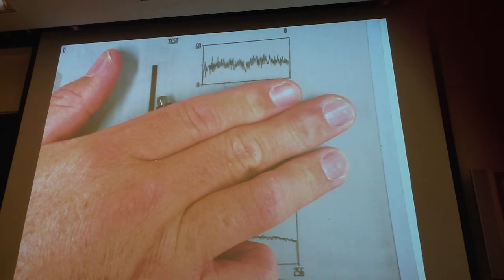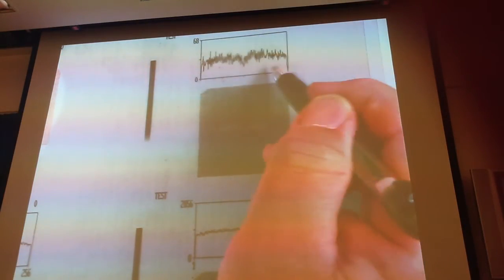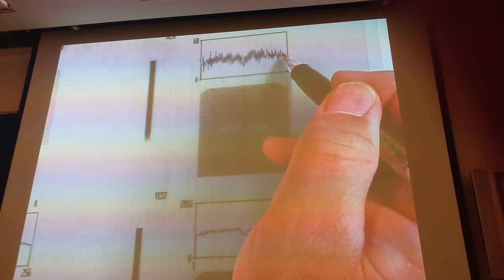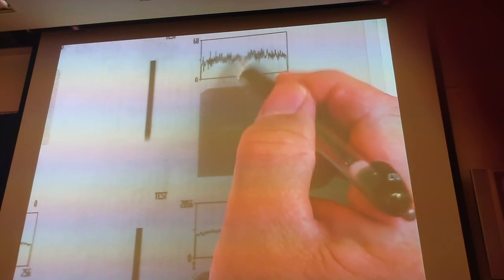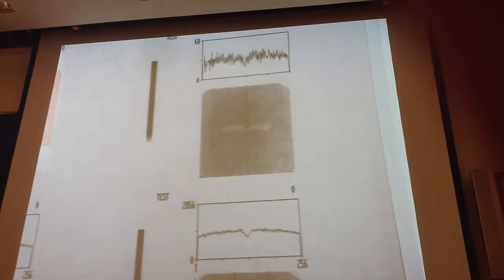This is the actual video signal that goes to your computer. The computer is going to divide this up into 64 equal slices. Whatever the voltage is there, that's the number that gets recorded in that address. If I made it 128, all of these pulses are the same duration. So if I go to 128 by 128, I'm going to divide this into 128 equal time segments, and that's going to represent this image on my computer.